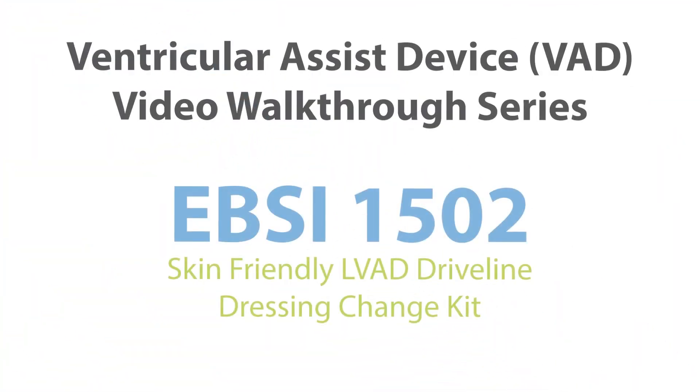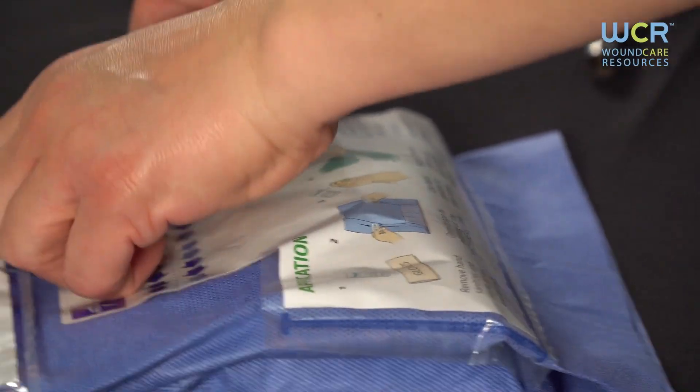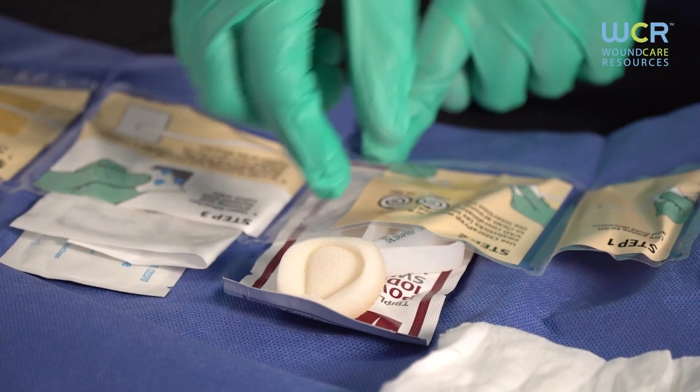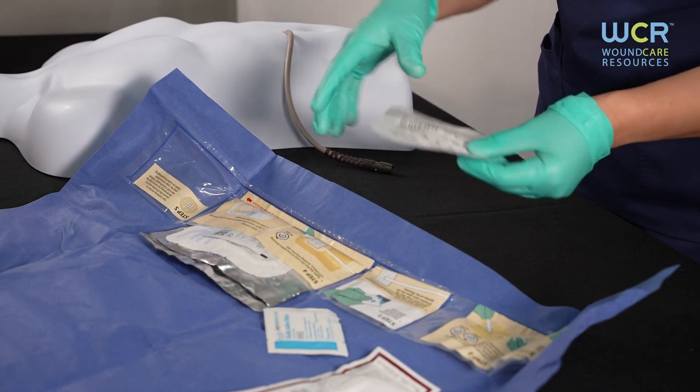This is an instructional video to assist caregivers in performing a VAD driveline dressing change. EBSI 1502 is a skin-friendly LVAD driveline dressing change kit organized to help take you through a step-by-step process, walking you through each step in the correct order while maintaining sterile technique. Each step is numbered and labeled with the supplies needed, organized in its own pocket with pictures and instructions.